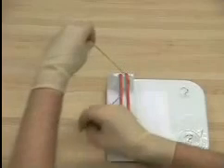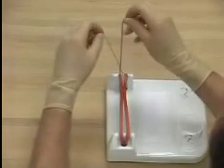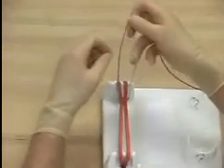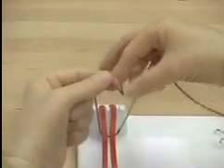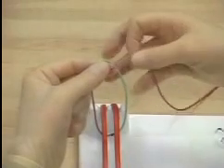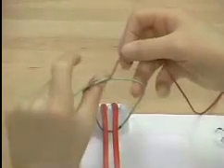This knot lends itself to usage in tying a surgeon's knot. Again, the thumb is placed through the inverted four, and on this occasion, a double throw is placed prior to placing the suture in position.